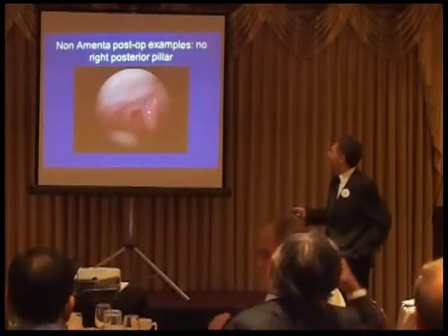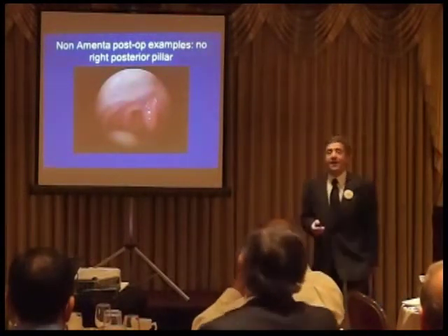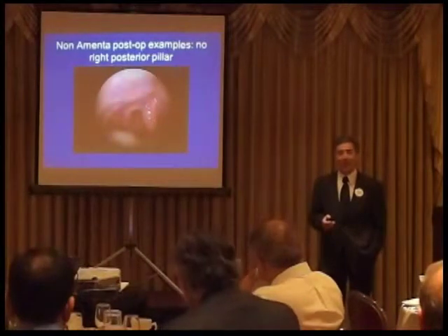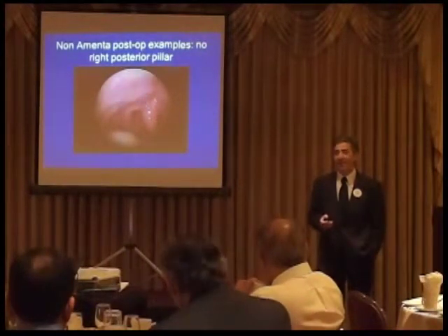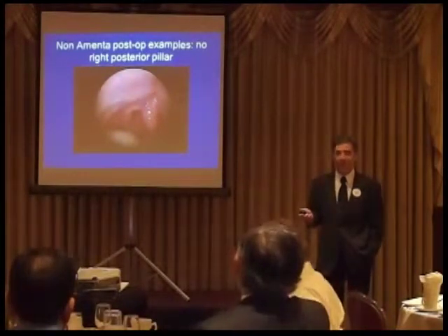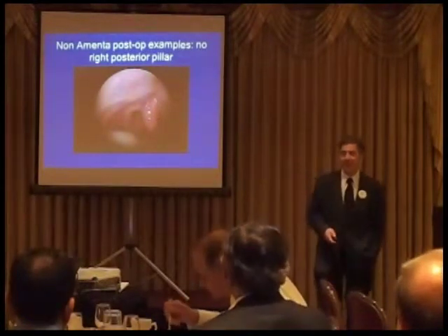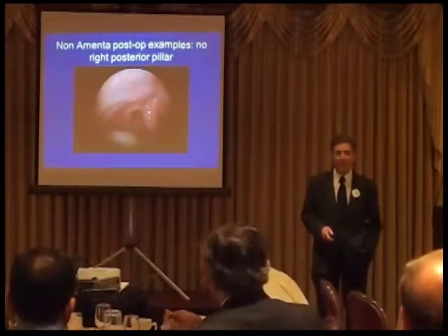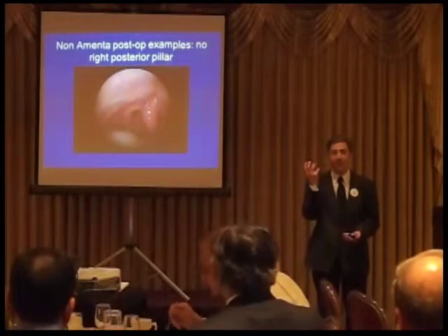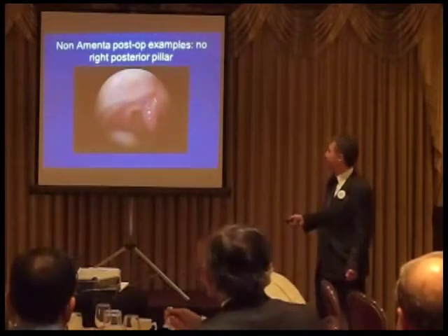Okay, you heard that. So, excuse me, do you apply the same technique for adenoidectomy also, for adenoids? The adenoids, I just use a sharp curette and the suction cautery, because the adenoid area is very resistant to pain, resistant to bleeding. That's why when you have, and Dr. Gindi knows this, when you have nasopharyngeal carcinoma, usually the first thing you see is like a neck met. You may get skull-base pain, but that would be advanced. Usually you don't have anything happening in there, so it's a relatively dead area.